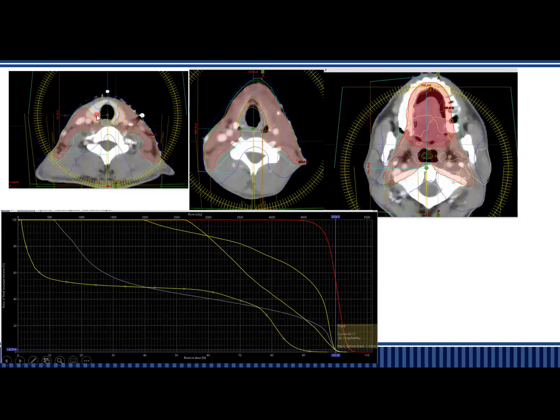The island regions. This is the same patient volume in different slices, and you can see the volume is spreading here and then here, and this is the coverage here. These are the areas where you get some 95 or 90 coverage. So you have to make avoidance sectors to reduce the doses on these islands, because sometimes rings don't work well on these areas.